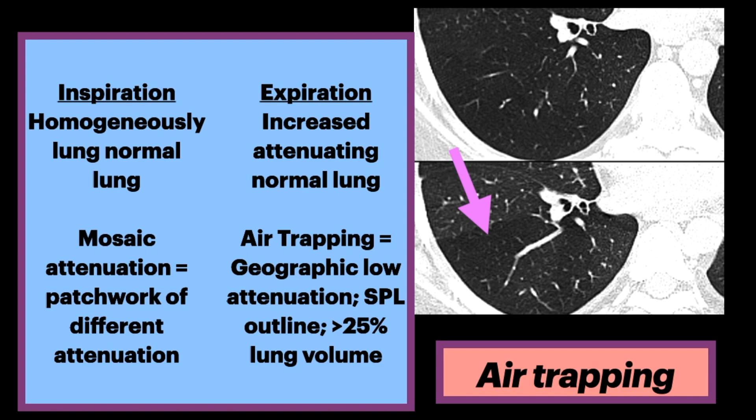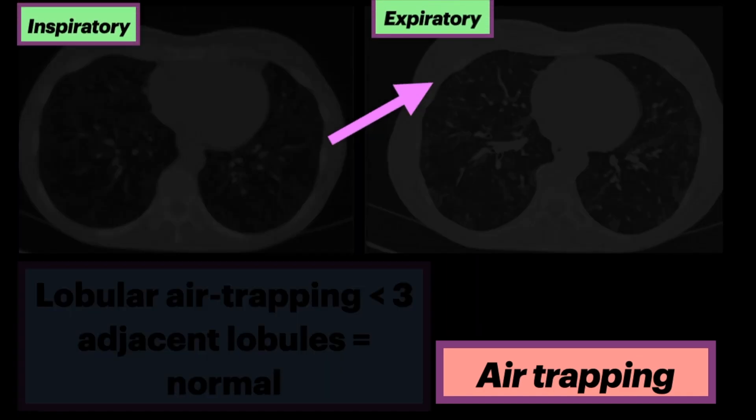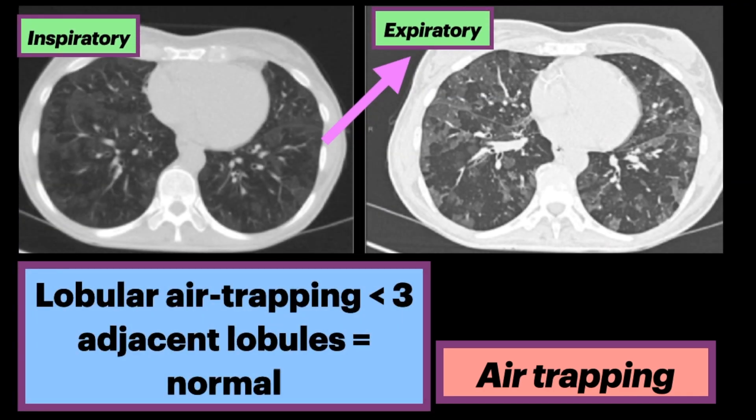On the right, we see a composite image of a patient with constrictive bronchiolitis — inspiration at the top and expiration at the bottom. The expiration image shows areas of air trapping that manifest as geographic areas of hyperlucent lung. It is not limited to lower lobe superior segments or lingular tip. Lobular air trapping less than three adjacent lobules is considered normal.